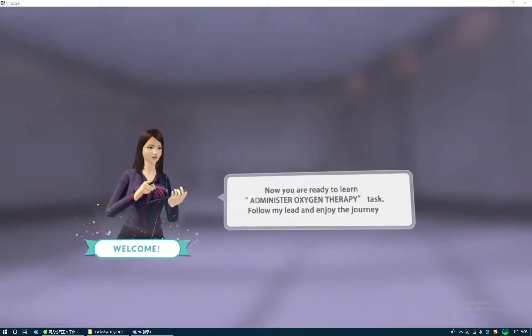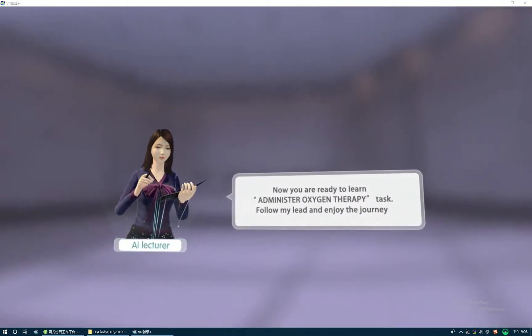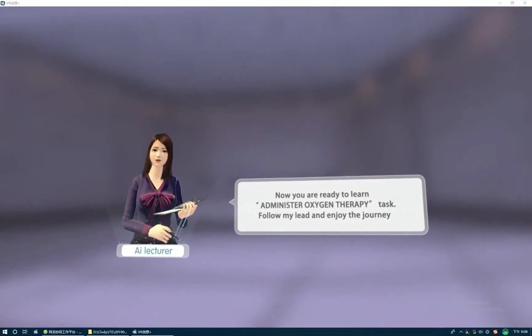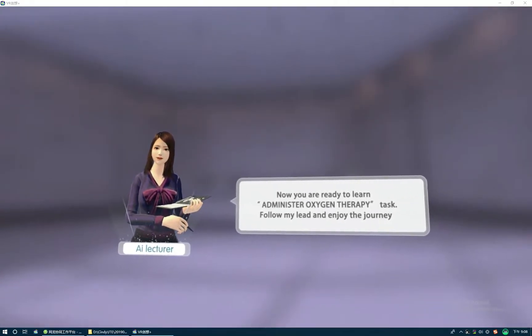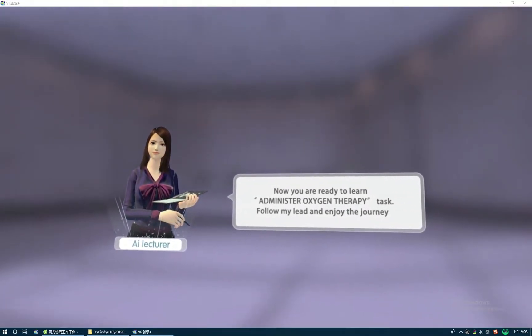Welcome! Now you are ready to learn to administer oxygen therapy tasks. Follow my lead, and enjoy the journey.